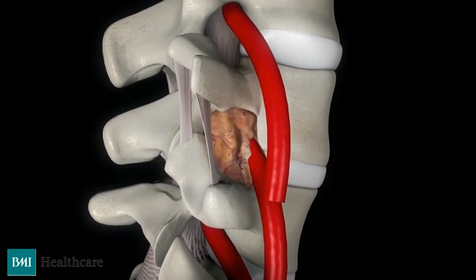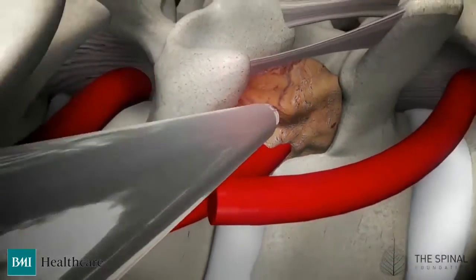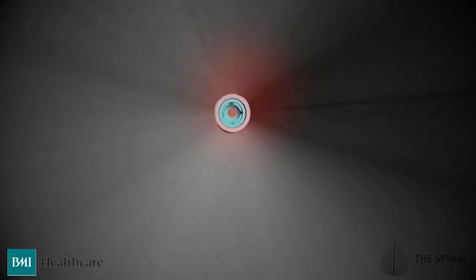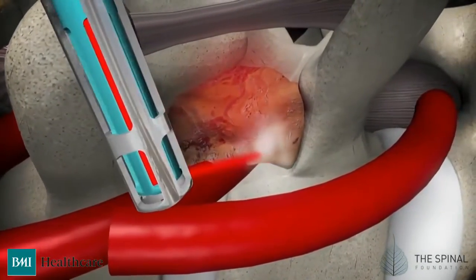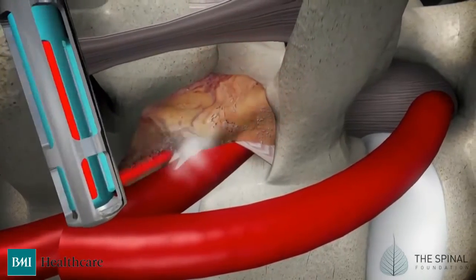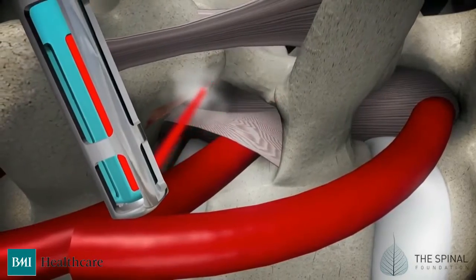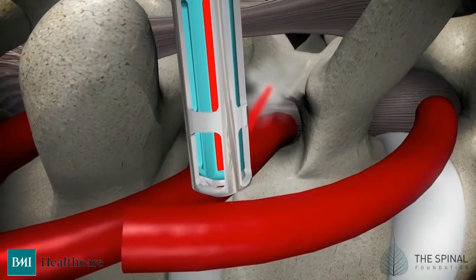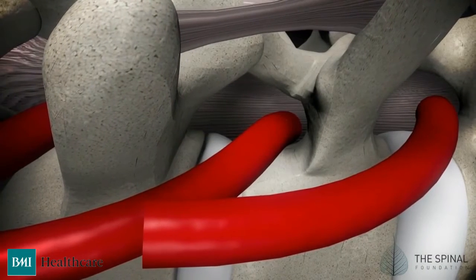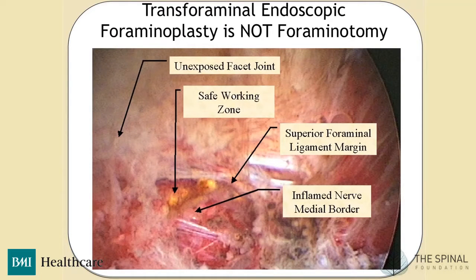So we're coming at the patient not from behind the patient or through their tummy, but transforaminally. Now, this is a fairly new little video, and it did start out a week ago like Star Wars, and I wish the procedure was quite as simple as this, but we are using a laser to cut away the scarring and the bone and ligaments that are trapping the exiting nerve root through the foramen. And that last ligament is the superior foraminal ligament, which cannot be accessed easily from midline approaches. And therefore, midline approaches tend to under-treat the problem at a foramen.